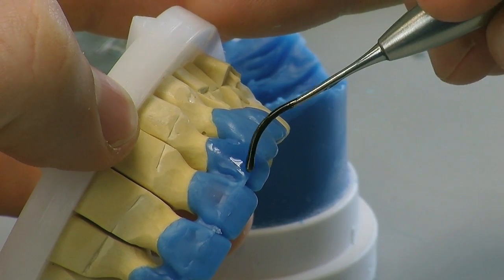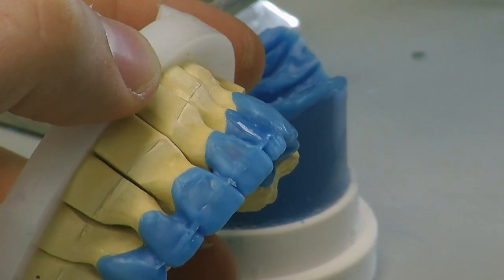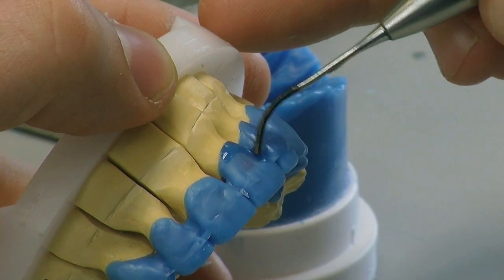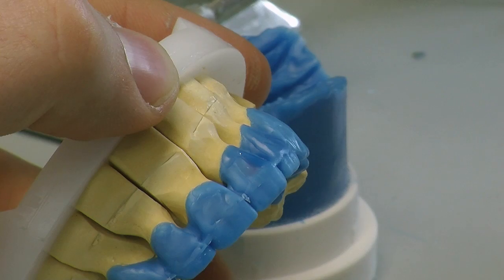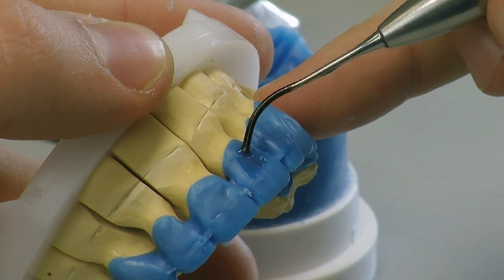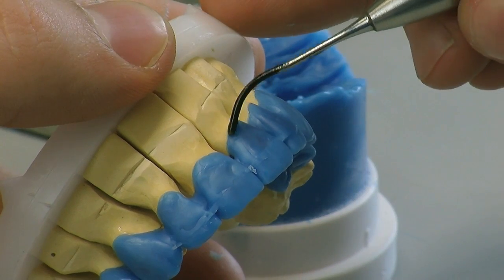And then of course you can measure between your incisal edge and your margin to verify with the dentist's notes, which are taken using digital calipers in the surgery and in the laboratory, that they're exactly the same. And we're doing all this before we do our cutback. So we're just going to carry on now, filling in these spaces and getting our contour right.